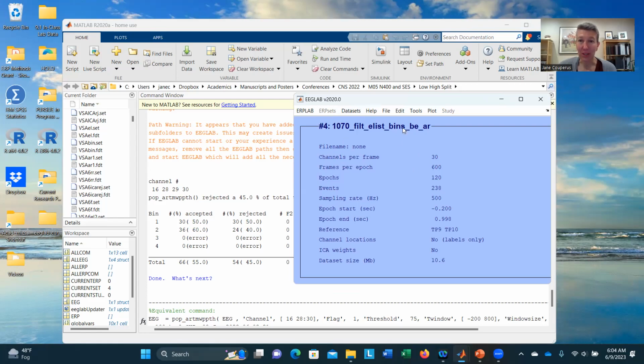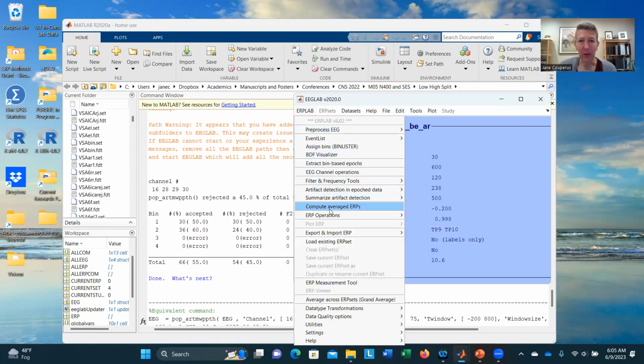And I'm just going to average this one file just so you know how to do that so that you can look at it. But you would have to go back to whichever data set had the artifacts you wanted to average to look at that particular average. So I'm just going to do that for set 4. You would go to compute averaged ERPs.